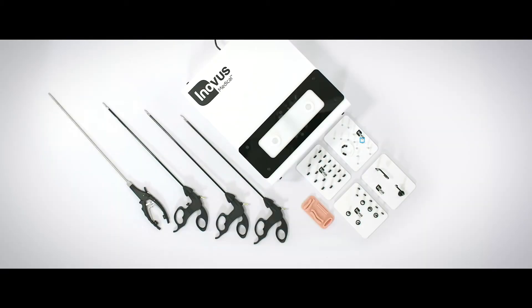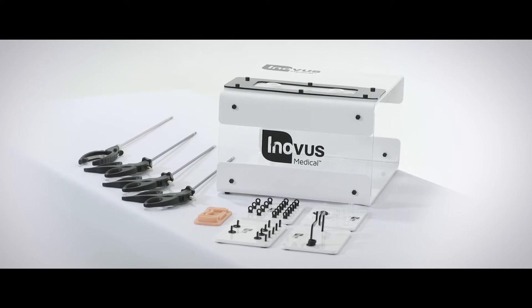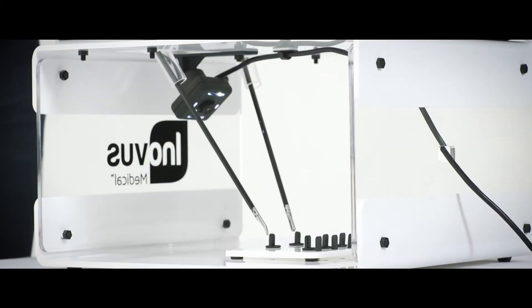It also comes with a number of skills tasks including our bead stack task, our maze task, our ring stack task, and our threading task. All of these bases are designed to allow you to build and work on the skills of laparoscopic surgery such as bimanual dexterity, depth perception, and understanding the fulcrum effect.